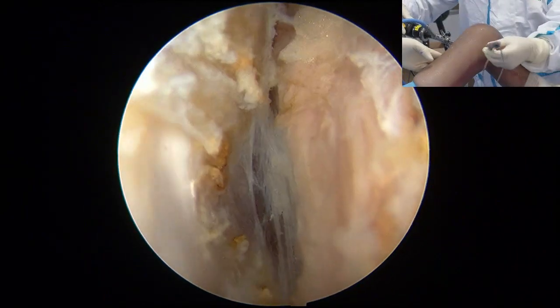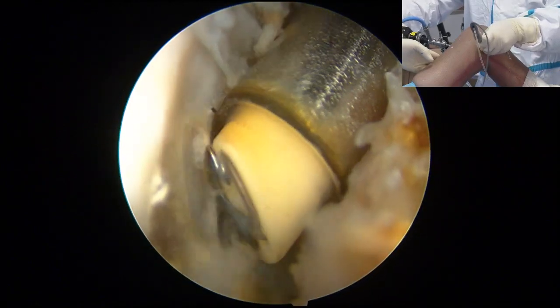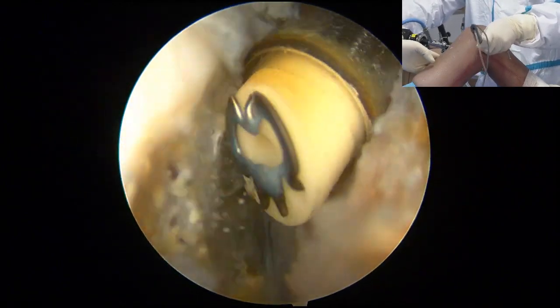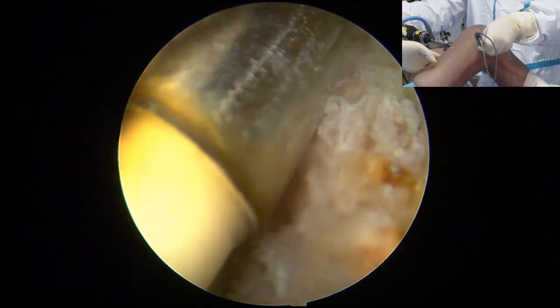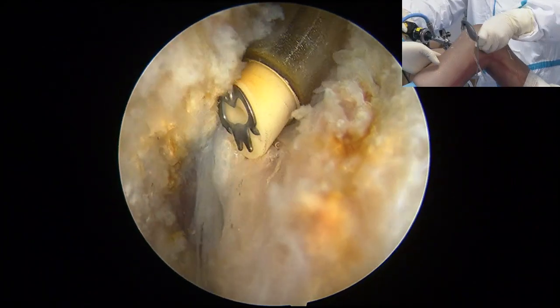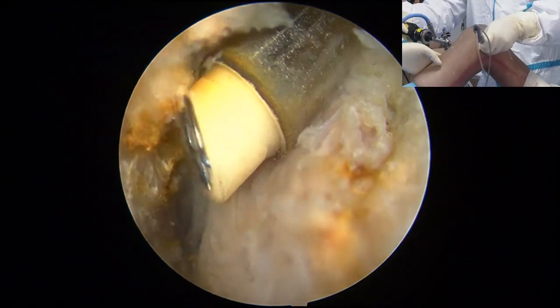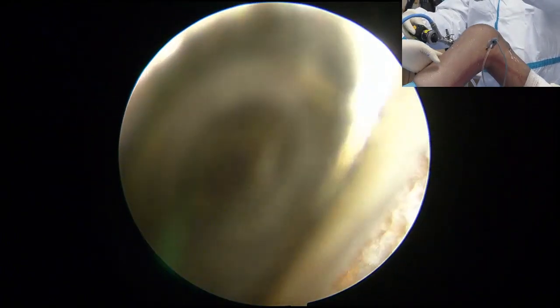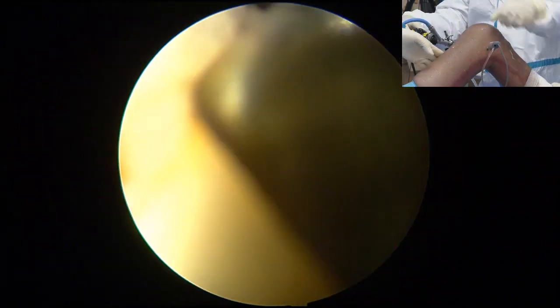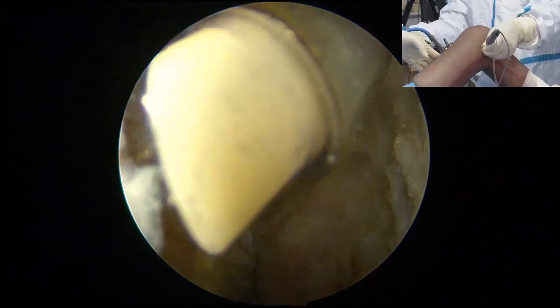Okay, here you look at this. Okay, so now the angle starts to change here. That is the attachment of the PCL. Okay, that's it. The tibia, the bone is there. Okay, so this is our landmark. That's the end of the PCL attachment. So the PCL attachment, you have to be low enough. The problem is sometimes you go too high, you cannot hook the tibia. You know, when you do PCL reconstruction, it's like you hook the tibia, because a lot of gravity pressure to the back, right? If you're too high, you just have point contact. It's not strong enough to stabilize the posterior translation. Okay?